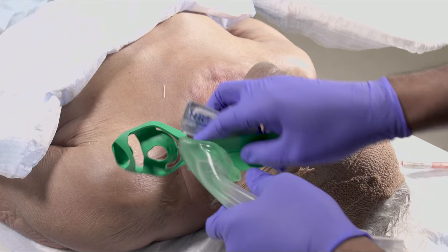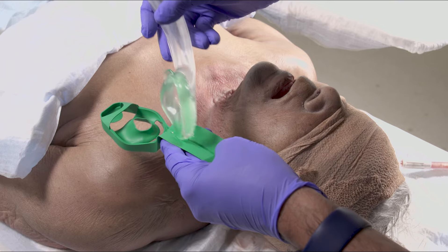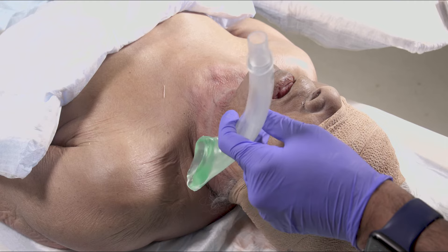Take out the iGel but keep it in the cradle until you're ready to use it. Remove the iGel and place a pea-sized amount of lube in the dimple in the cradle.